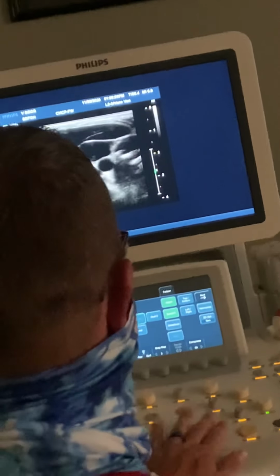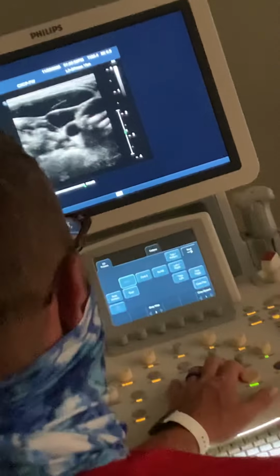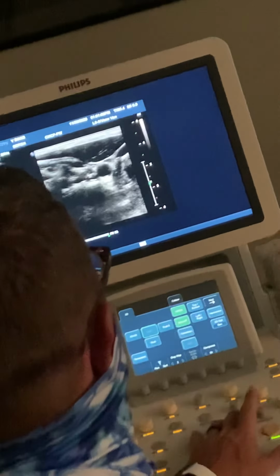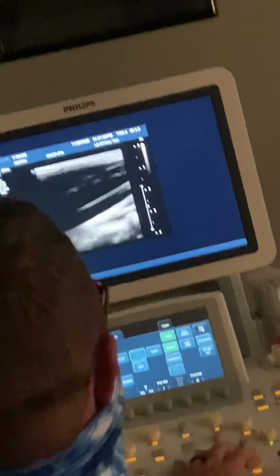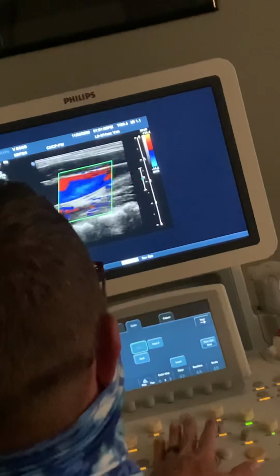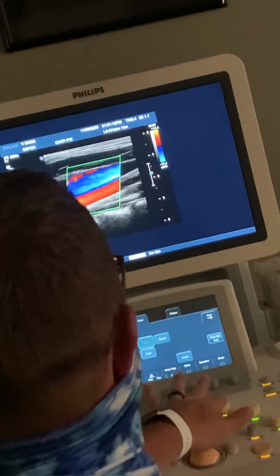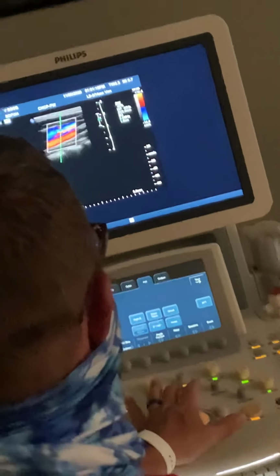So we're going to take it transverse, right? Internal jugular vein, or IJV, with or without comp. Okay? We're going to take a color image as well. Be a little bit careful because it's easy to compress, yes? Take a color, SAG with color. And we're going to take a Doppler.